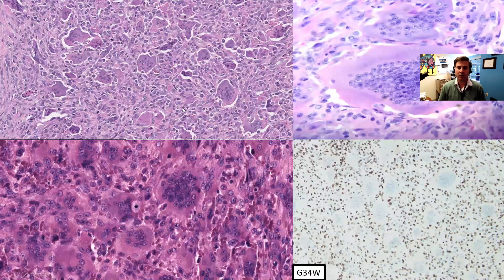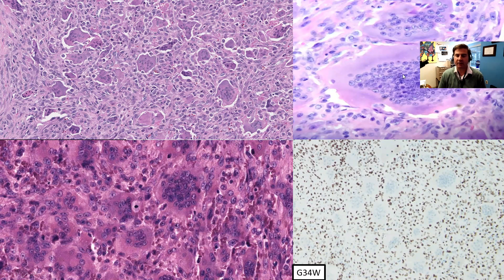At higher power view, this process is composed of mononuclear cells that are round to oval, somewhat spindled, as well as an admixture of osteoclast-like giant cells. Some of these osteoclast-like giant cells contain greater than 50 nuclei per cell. The mononuclear cells may show some scattered mitotic activity. Interestingly, these mononuclear cells have similar, if not identical, nuclei to the osteoclast-like giant cells nearby.